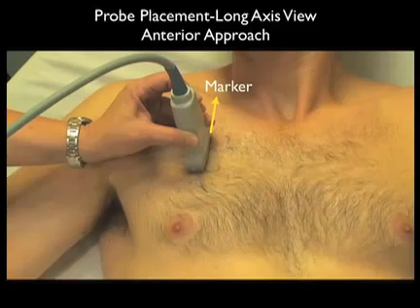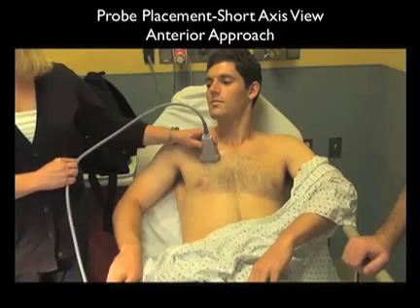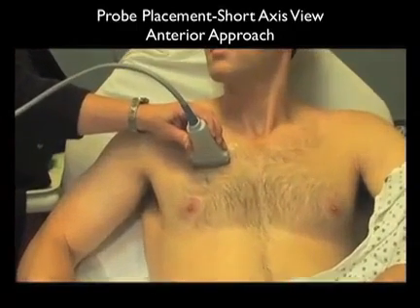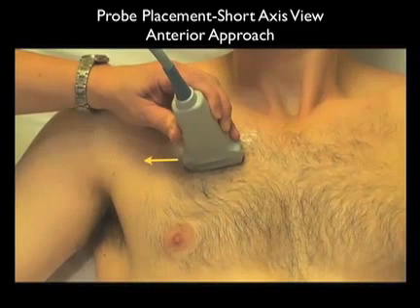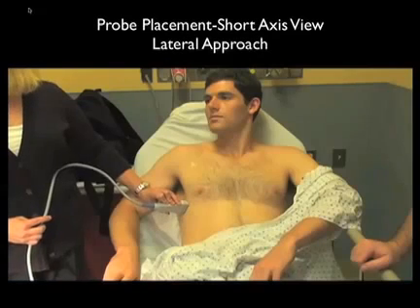Note we're looking at a long axis configuration between the ribs with a marker dot oriented superiorly towards the patient's head. Once we've identified both the ribs and the pleura, we can swivel the probe into the short axis configuration to further look at the pleura and to detect pneumothorax. Here we have the probe oriented in a transverse or short axis orientation between the ribs, looking directly down at the pleura. Notice in this case the marker dot is located towards the lateral aspect of the patient. Using both long and short axis configurations will allow you to detect a pneumothorax with a high degree of accuracy.